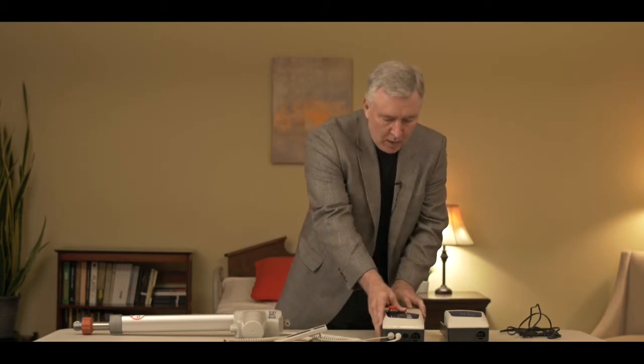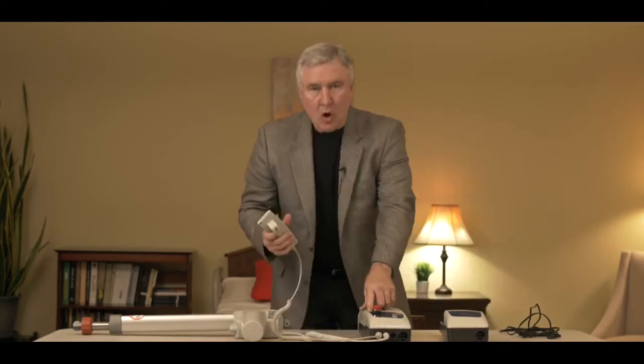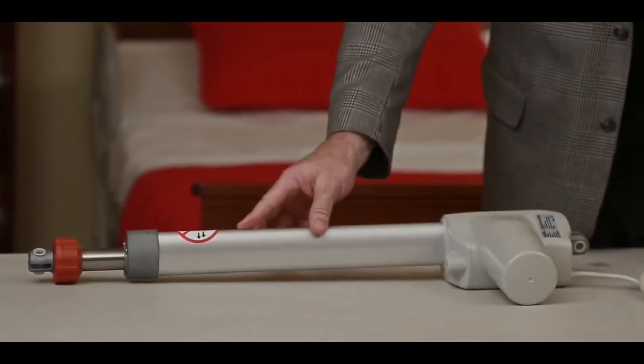So we talked about Style 2 before. You remember that it has a control box — looks like this. If everything was hooked up and functioning properly on your lift, we'd hit the up button, motor would go up, down button, and motor would go down. So let's break down each of these individual components and talk about some of the ways to troubleshoot them.